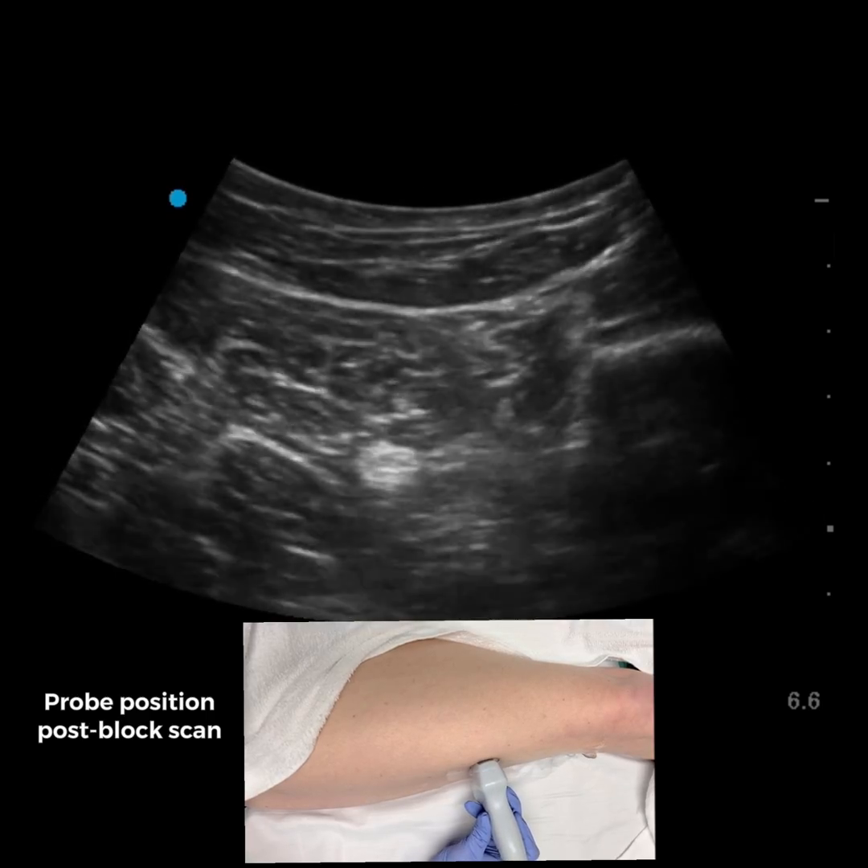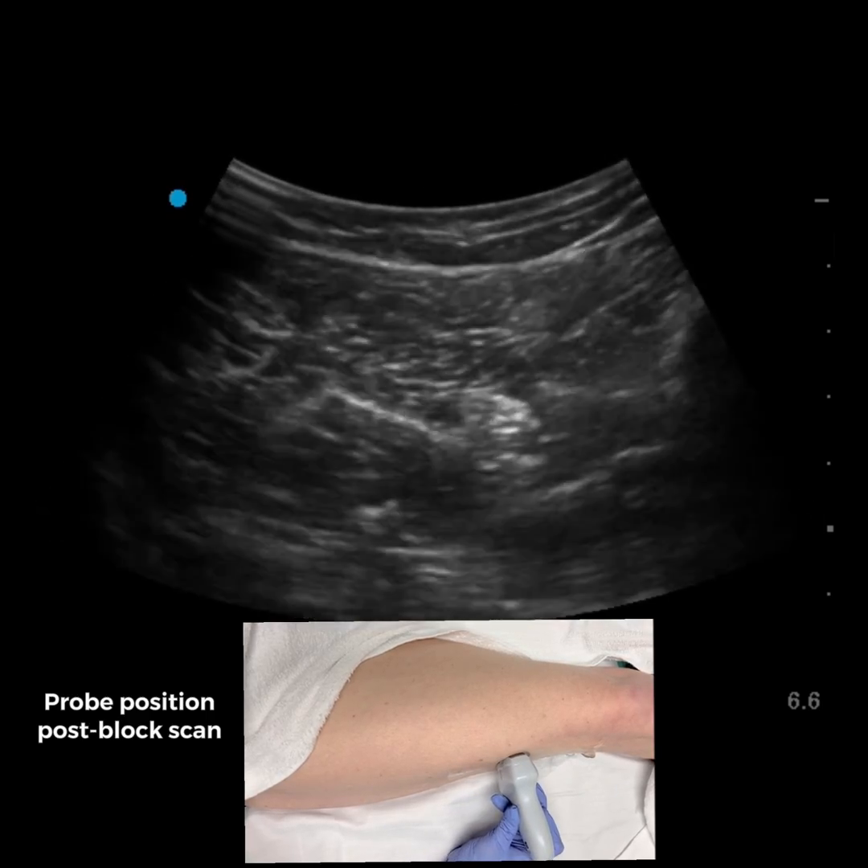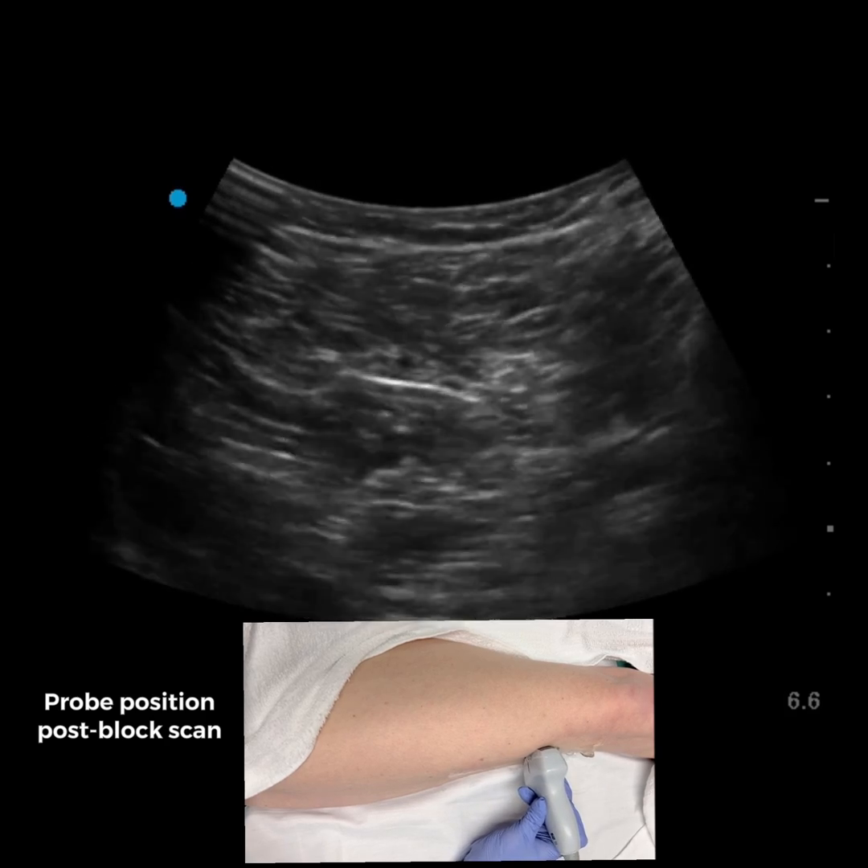In this post-block scan, we see the sciatic nerve is well surrounded as it divides into the tibial and common peroneal branches.